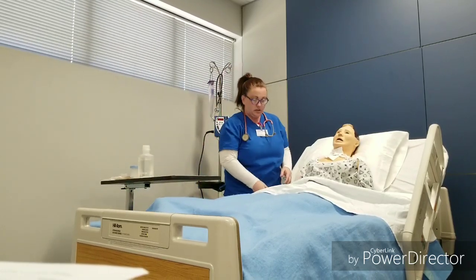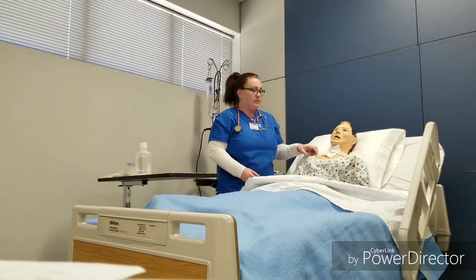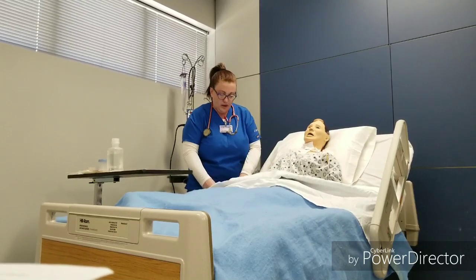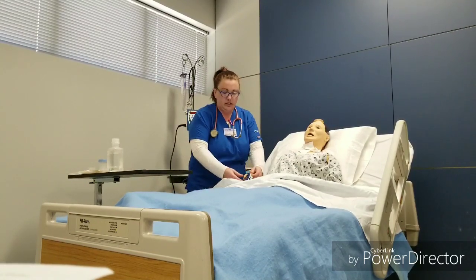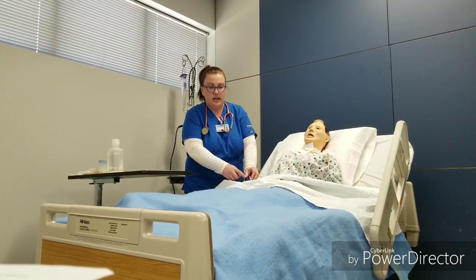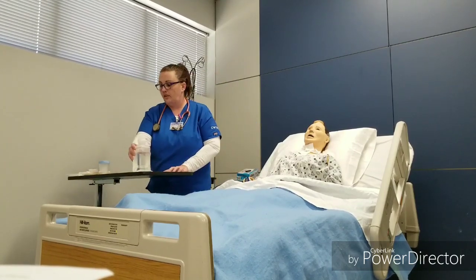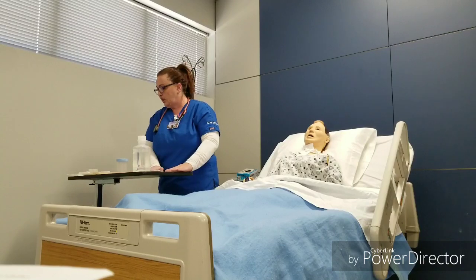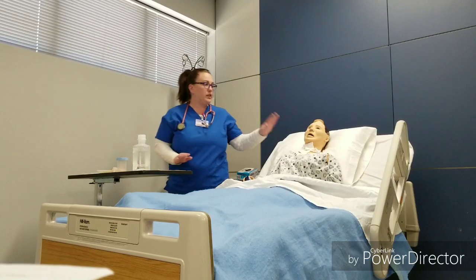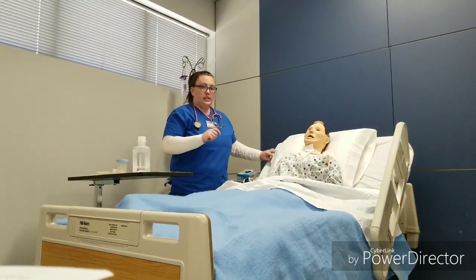If they don't have a pulse ox on, you can just watch for signs and symptoms of struggling breathing, their color, their respiratory effort. But I'm going to place pulse ox on and also assess for all of those signs. But this way I can actively see the reading as I'm doing this. You want to make sure all your supplies are within reach and how you want them. And I'm going to first go in the nose, and then I'm going to switch out equipment and go into the mouth.